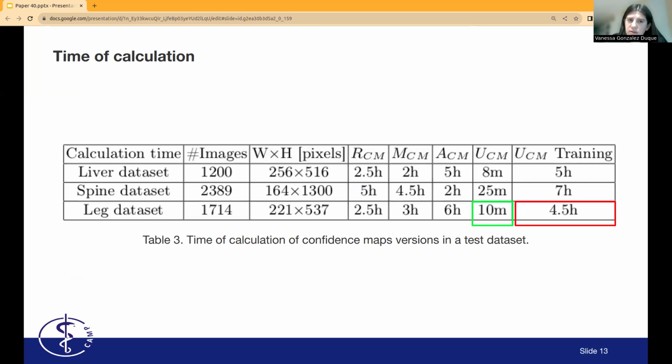We can have a long discussion about the calculation time, because remember that our method is patient-specific and anatomy-specific. We will just say that as soon as the method is trained on a patient, inference on a new test set of images takes just minutes compared with the hours that it would take for other methods. The generalization of this method to work on different participants, but anatomy-specific, is a work in progress.